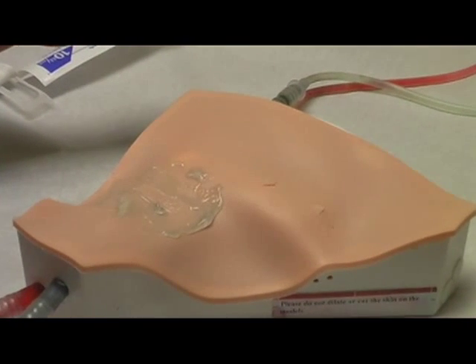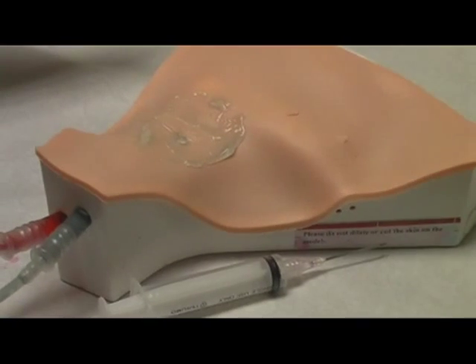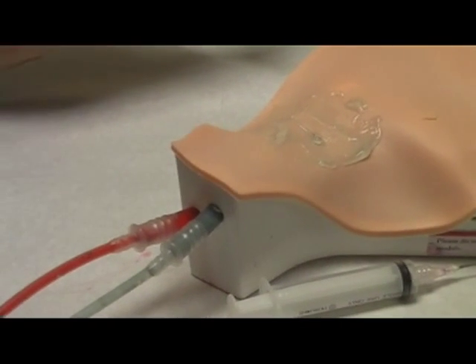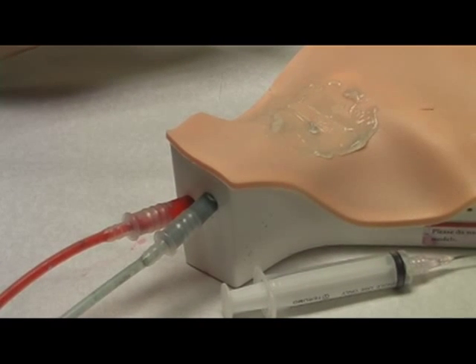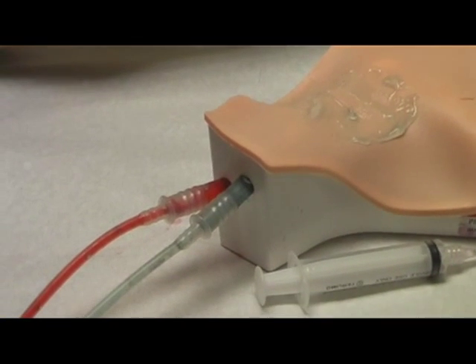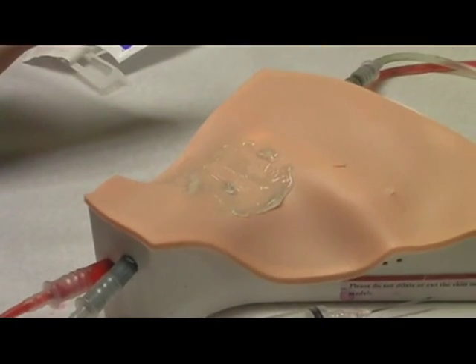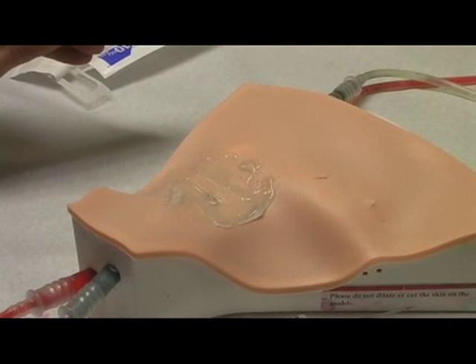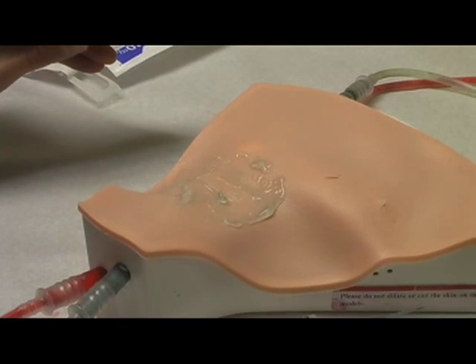Another nice feature of the model is that the two different ports, different colored dyes can be injected into the vessels, blue for venous, red for arterial. So as the student attempts cannulation of the vessel and draws back on the syringe, if they see the blue liquid, they are confident they are in the vein, whereas if they get red, then that suggests an arterial puncture.